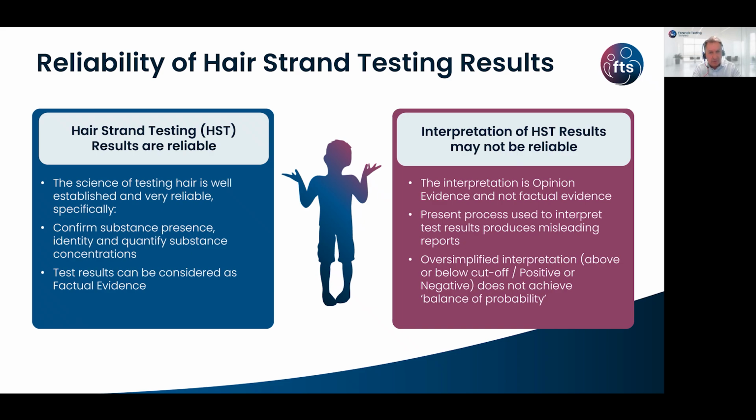So again, even if you understand to a certain extent what samples you're looking for and what that might give you, for instance PEth, if the report from the lab is not clear, it's not really your job to start to interpret these reports. You should go back to the lab, whoever you're using, and ask them to clarify if there's anything misleading in the report. And again, oversimplification of interpretation. If cutoffs are used, that's an oversimplification.